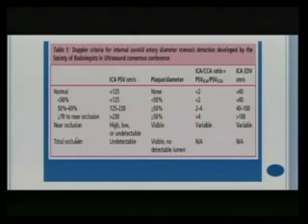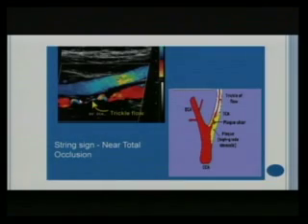This is one step. You are right here. And you are lucky that you are able to demonstrate that there can be a thin or a floppy wire that can be negotiated to cross this lesion, and then subsequently angioplasty can be performed with stent placement to recanalize this carotid.